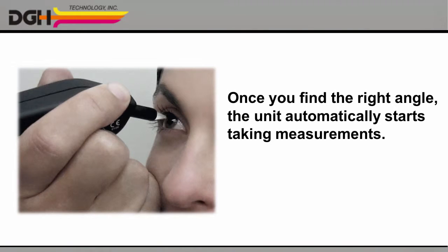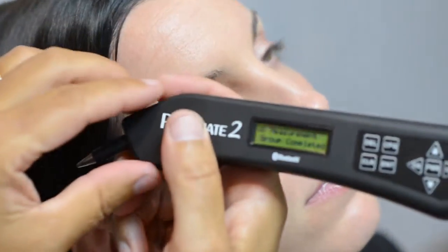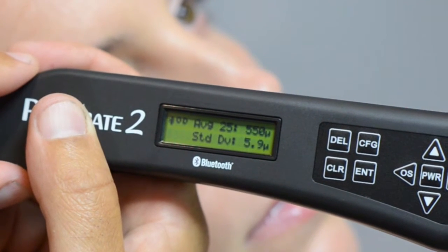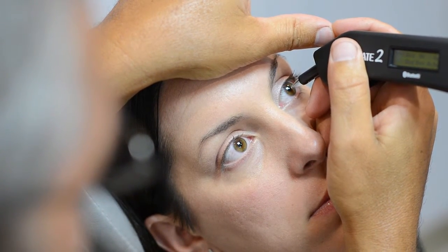Once you find the correct position, the unit will automatically begin taking measurements, and you'll hear a quick beep for each one. When you hear two long beeps, your first set of measurements is complete. The screen briefly displays your average measurement, and then it prompts you to move on to the left eye. Again, gently touch the probe to the eye and listen for the beeps.